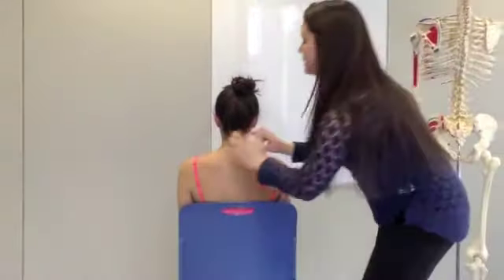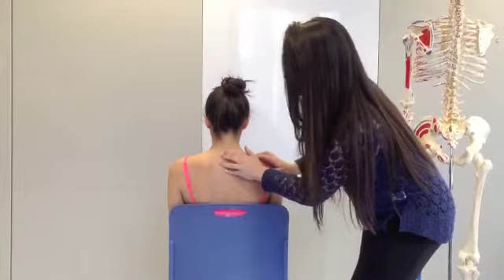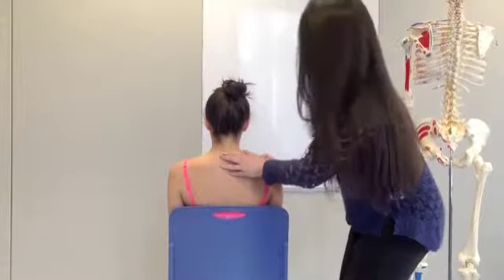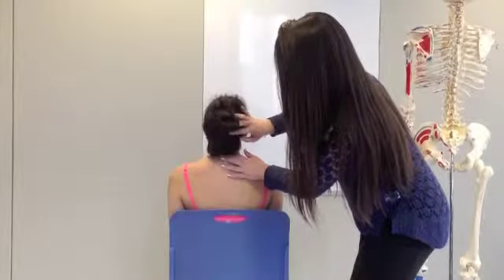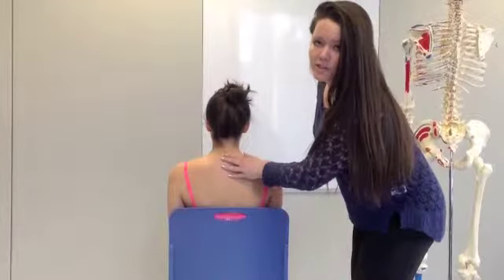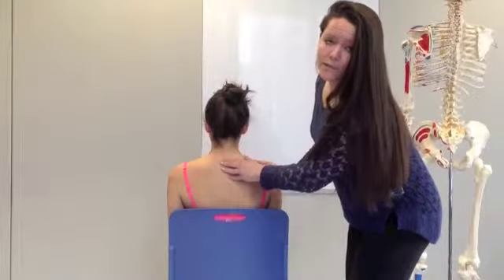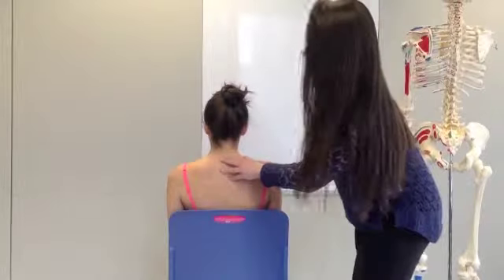To find C7, you would palpate for one of the most prominent spinous processes in the neck. Then to check and make sure you're on C7 as opposed to C6 or T1, you would have Kelsey look up at the ceiling. Perfect, and then back down. And what you're feeling for is C7 shouldn't move, it shouldn't dive deep when she does that, whereas C6 will. And then T1 also won't move, so you want to make sure you check the vertebrae above if it's not diving deep, just to make sure you're on C7 and not T1.